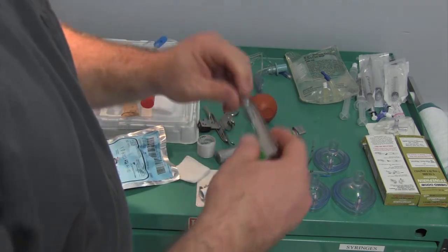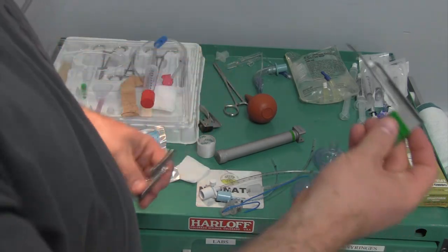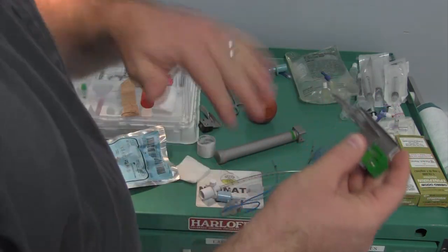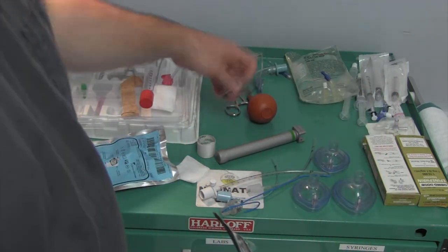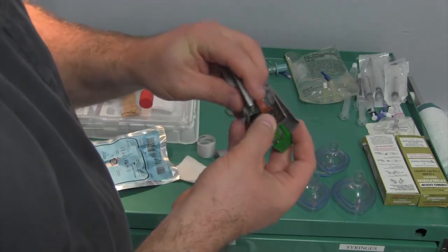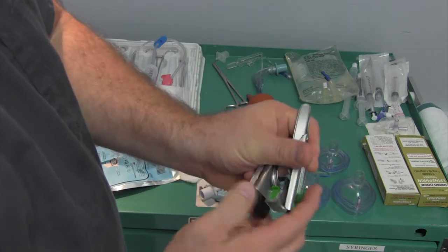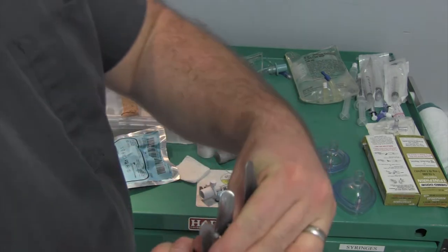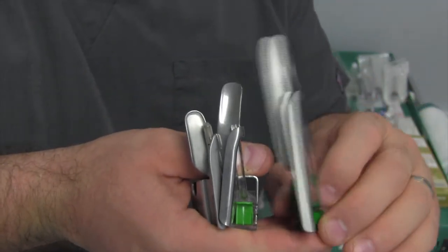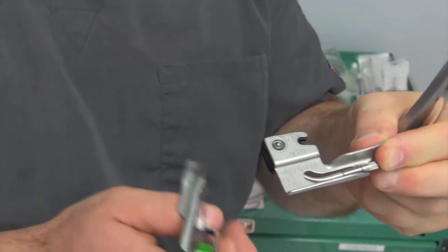For the blades, these are all Miller blades - a straight blade. We have a Miller one, a Miller zero, and a double zero. The double zero actually isn't made for this handle, but we have it here just to show the three sizes. You can see the size difference - that's the one, the zero, and then the double zero right here.